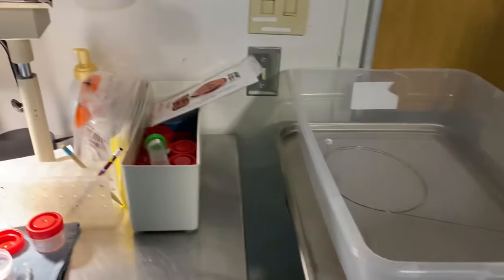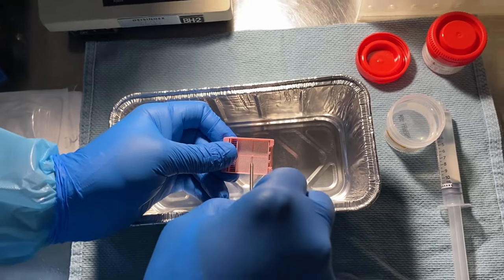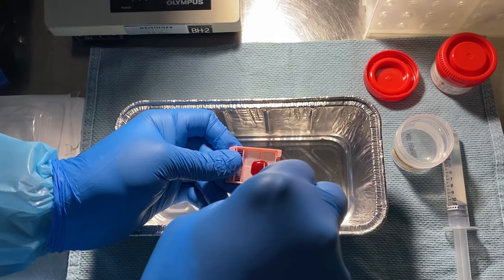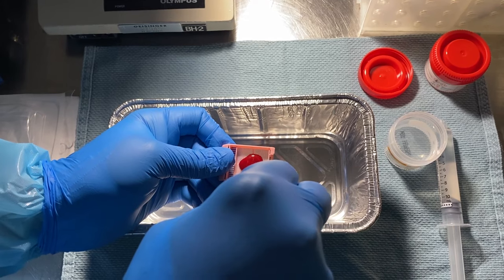The needle is pushed out to about two centimeters, and then a heparin heplock syringe is attached to the end of the needle. The heparin is gently flushed through the needle, which expresses the tissue out onto a tissue sieve.